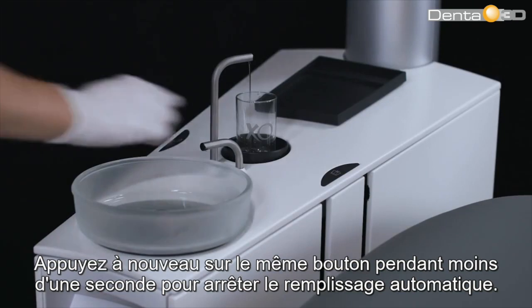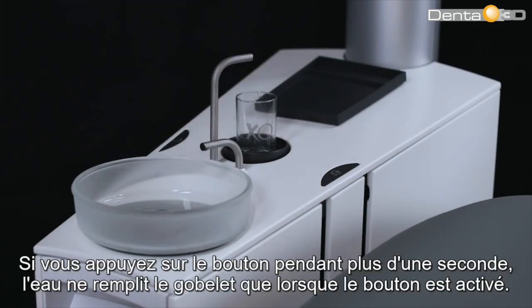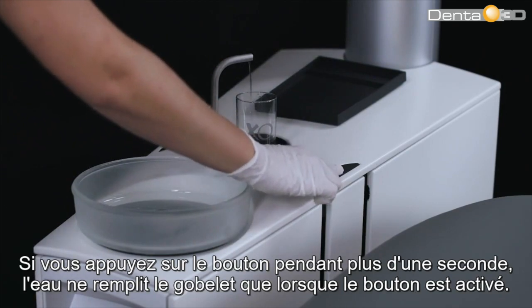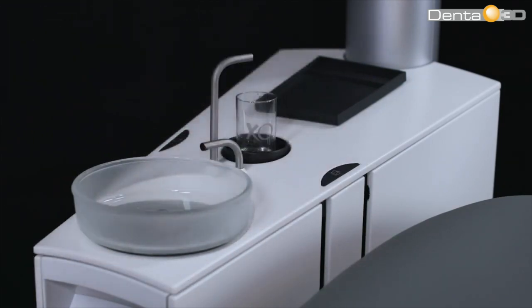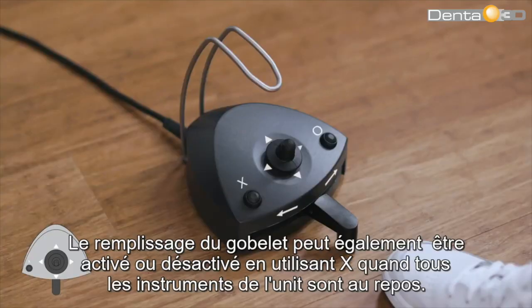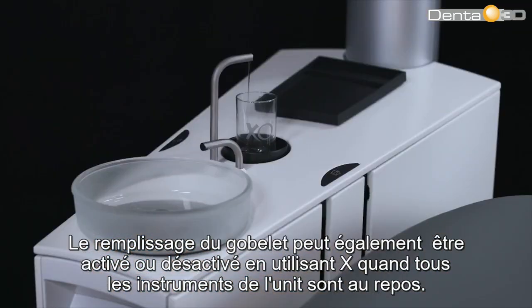Push the same button again for less than one second to stop automatic filling. If the button is pressed for more than one second, water fills the cup only while the button is activated. Alternatively, the cup filler may be activated or deactivated using the X button while all unit instruments rest.